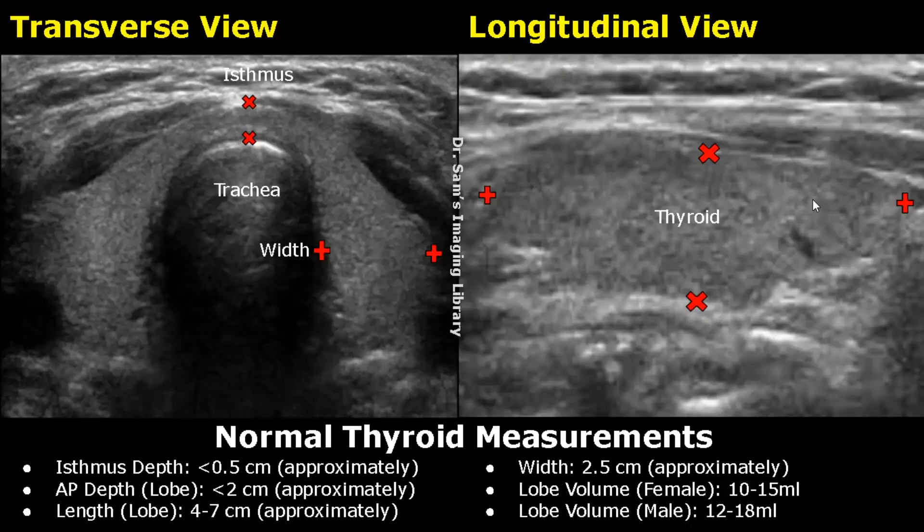The depth is measured by placing one caliper at the anterior margin of the lobe and the second caliper at the posterior margin of the thyroid lobe. The depth is usually less than 2 cm.